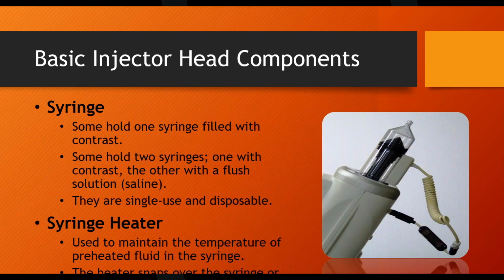a computer will take the 2 identical images, and X-ray or digital images are made up of pixels, all right? So it compares the 2 images, and all the pixels that did not change from one shot to the other get deleted. Then they only keep the pixels of the contrast shot where the pixels did change in darkness between the two. So if you've ever seen one of those 3D images of a heart, it's just the blood vessels around the heart or something like that, that's how they do that.